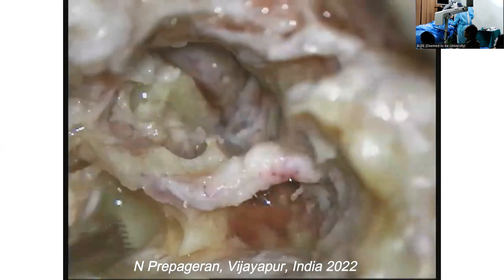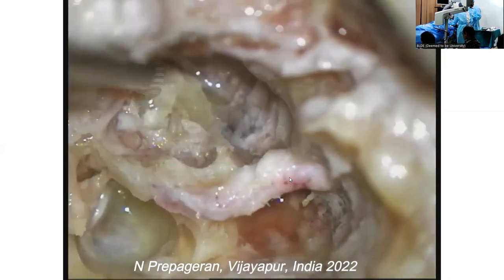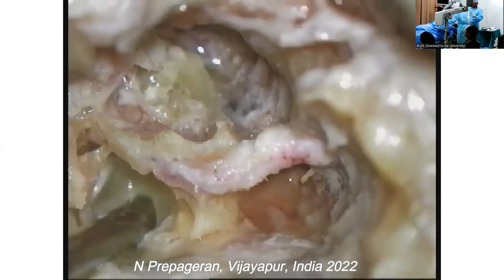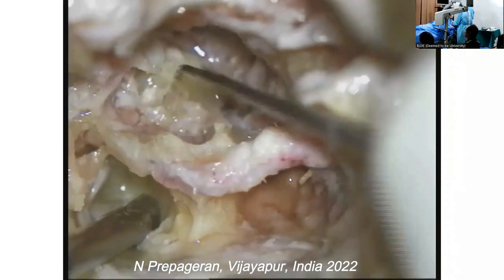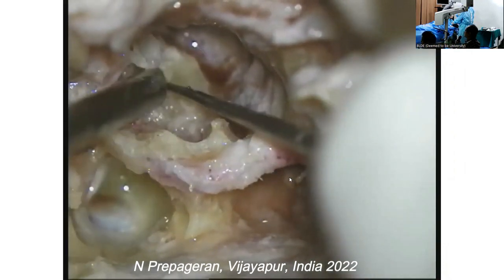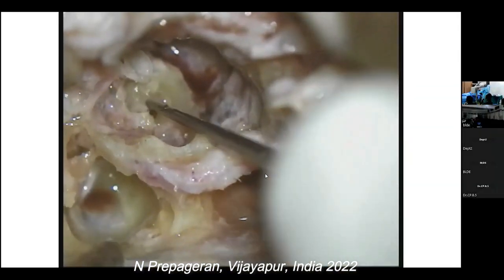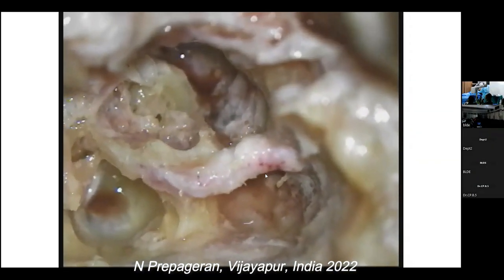Can I have a pick again? Okay, give me a pick again. So this should be your second turn up here. There, guys, can you see the second turn up there? Yes. There, second turn. Okay, let's insert the electrode.